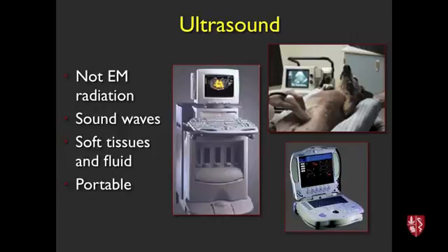Ultrasound. Okay, so this is a little dog having an ultrasound. My dog had an ultrasound fairly recently too, and it cost me like $500, but I'd have to be HIPAA compliant here, right? So it is useful in veterinary medicine. No radiation, so obviously it's used for things like imaging the pregnant uterus and all kinds of other things, and uses sound waves, very safe.